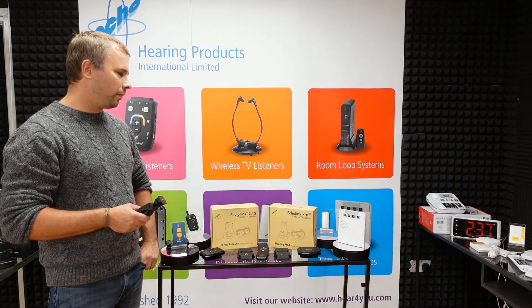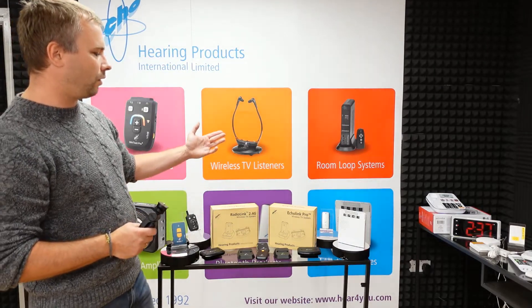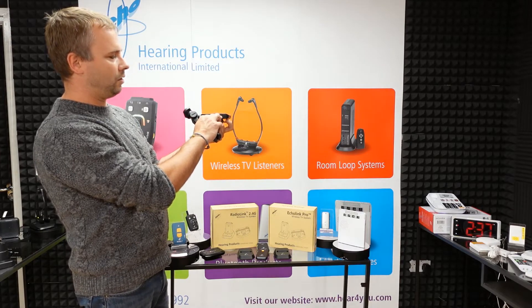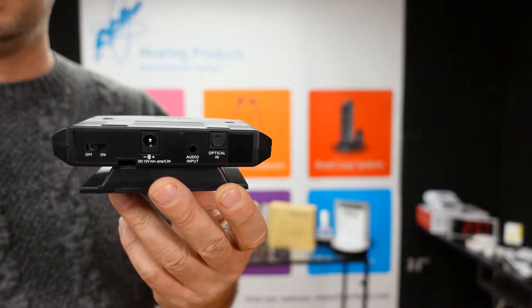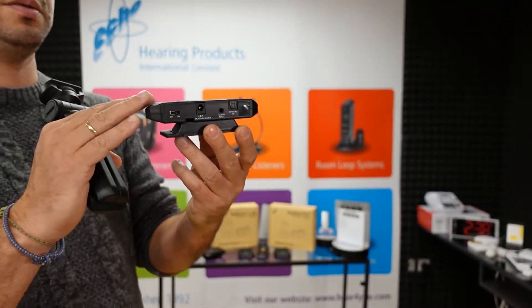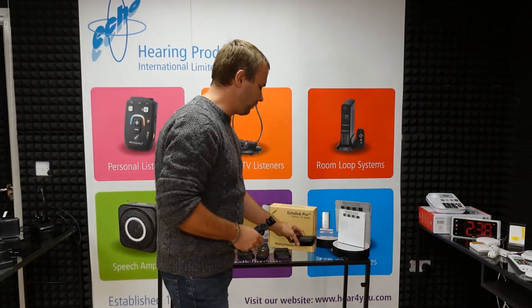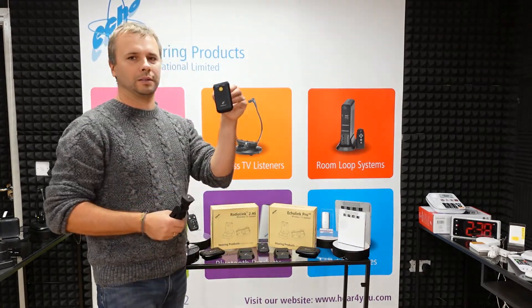What you do with this TV listener is: you have a small transmitter which will transmit the signal from your TV. You have to connect it through analog or optical — we provide both options. The transmitter has a power input and a power on/off switch. This small transmitter should be connected to your TV and a power socket, and when it receives a signal from your TV it will transmit the signal wirelessly to the small handheld receiver.